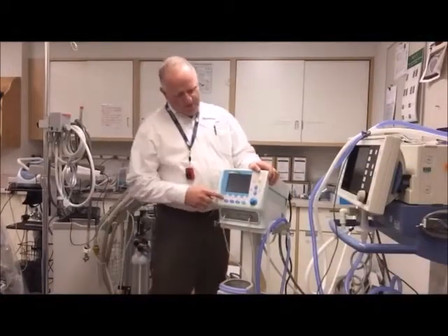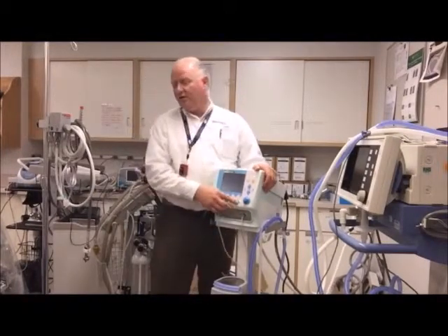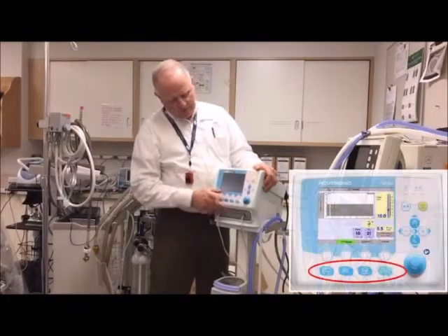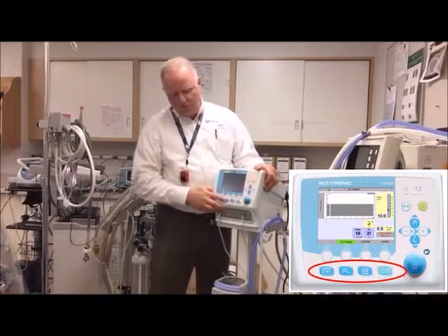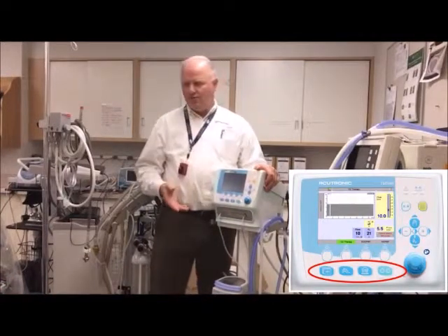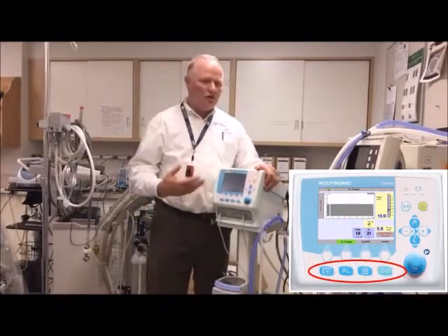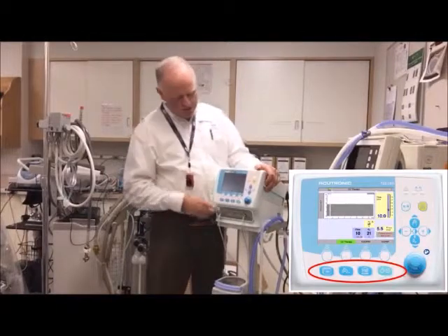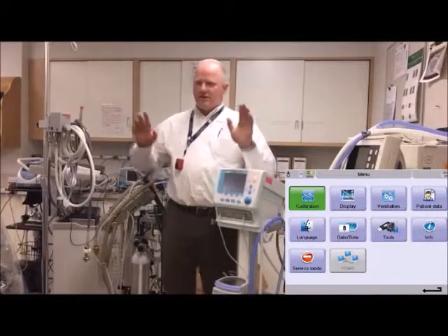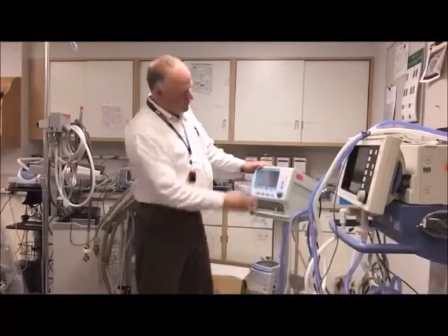These other buttons: this one turns it on, puts it in standby, or turns it off. This one takes you to your home menu. This one is your monitoring button — it also lets you freeze waveforms or go into trends. This button here gives you all your sub-menus so you can configure settings. And this button, like everything else, is a click-to-adjust. It's also a touchscreen, so you can touch whichever feature you want to adjust.